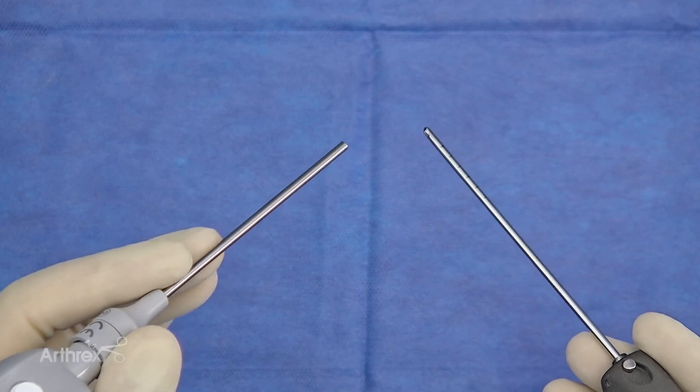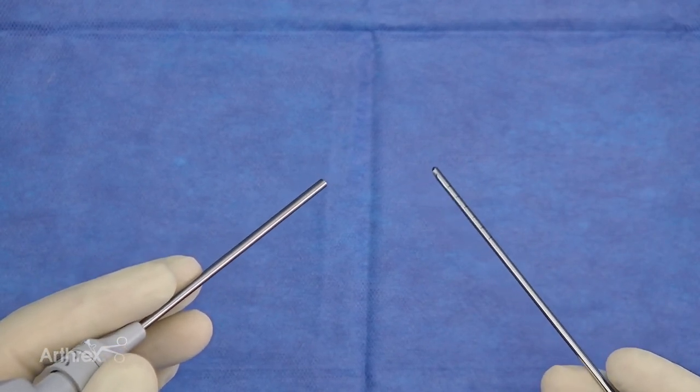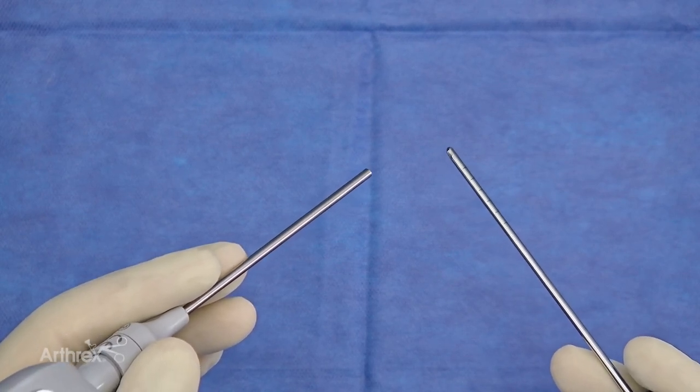As we evolve to using more nano arthroscopy, you can see the grip as well allows you to manipulate with finer movements and to allow for a better and more precise resection.